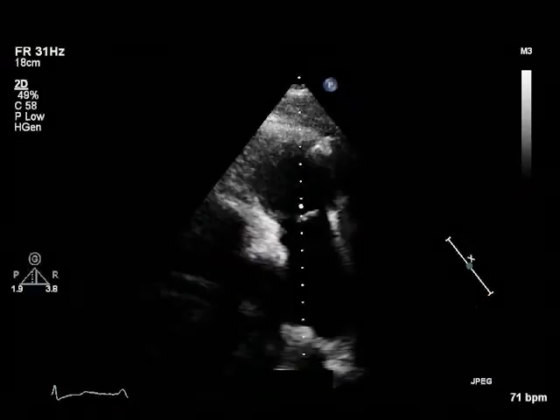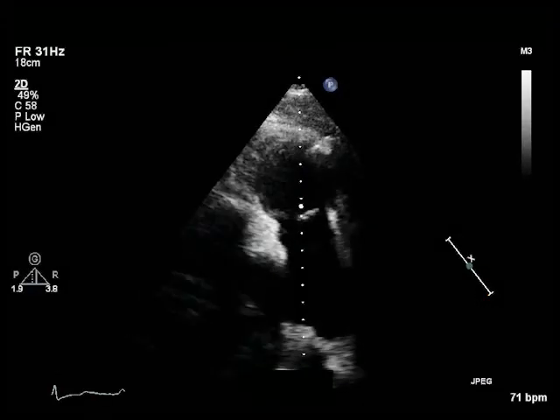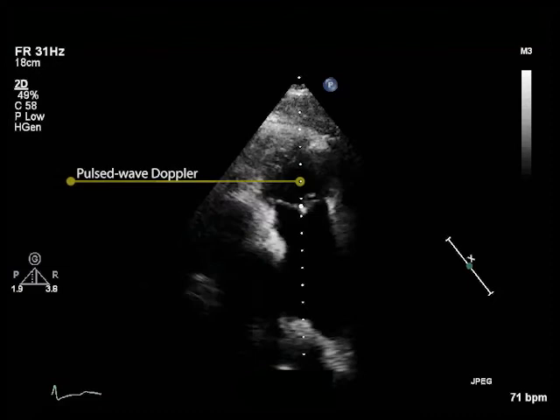The second view needed is the parasternal short axis view of the right ventricular outflow tract. In this view, we can obtain right ventricular outflow by using a pulsed wave Doppler with the sample volume positioned at the centre of the pulmonary artery, ideally at the annulus.